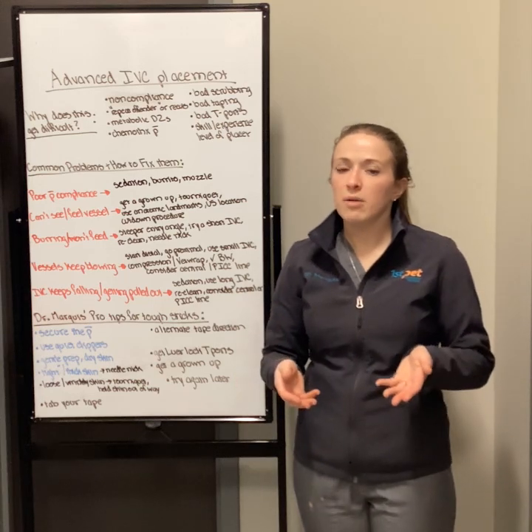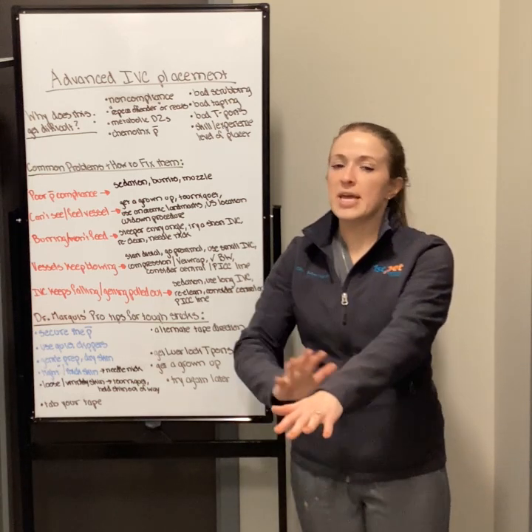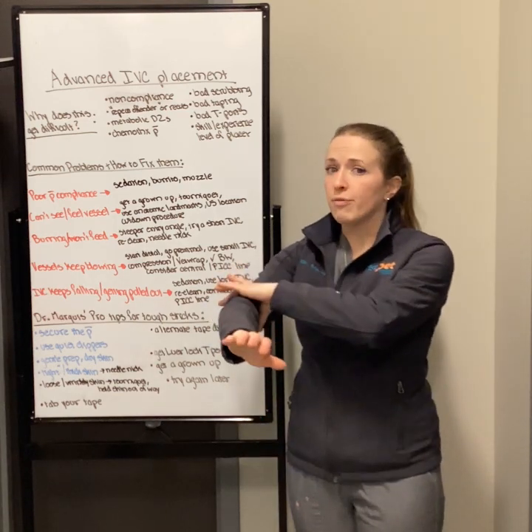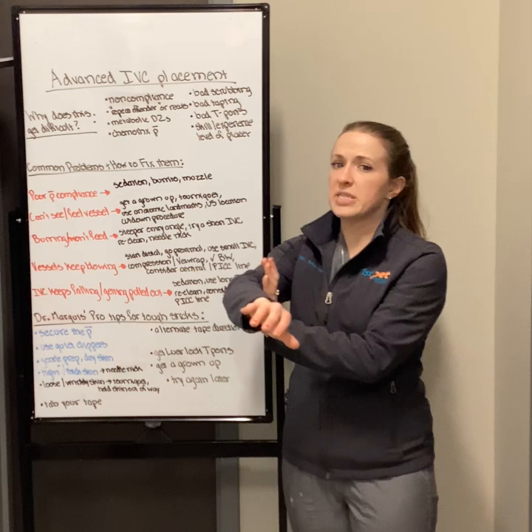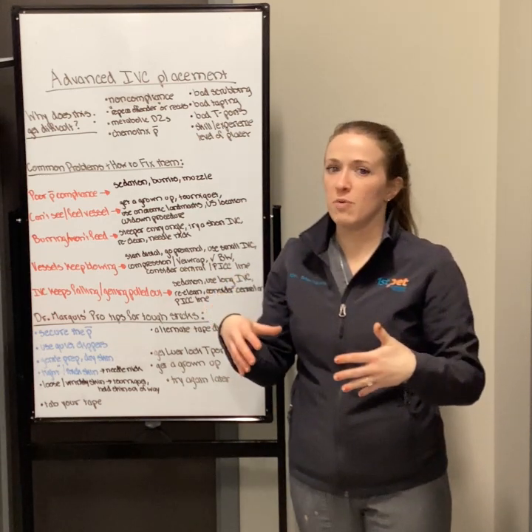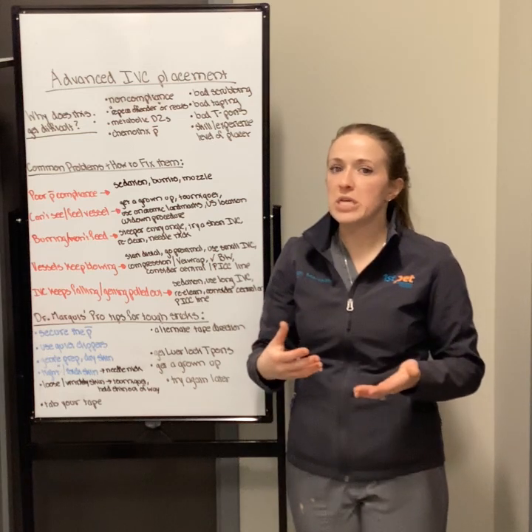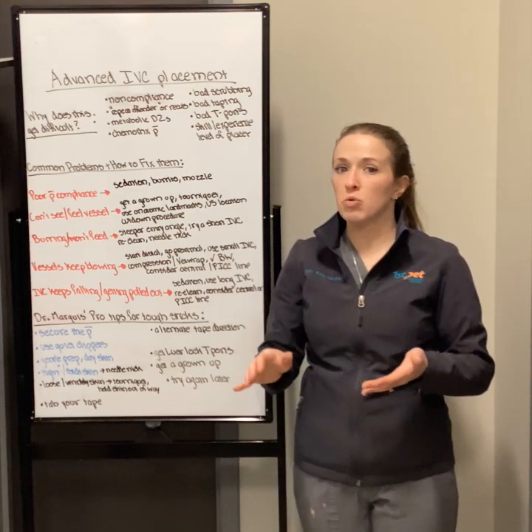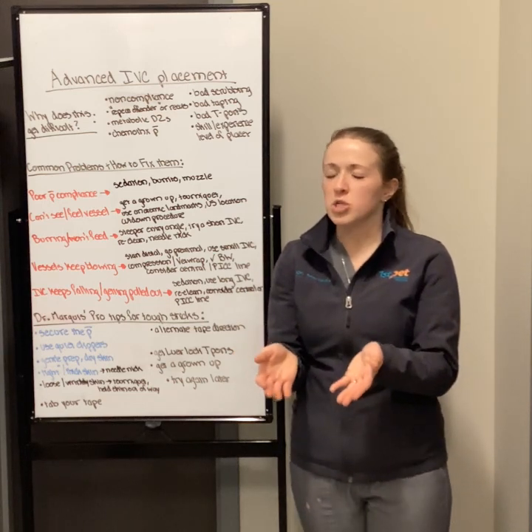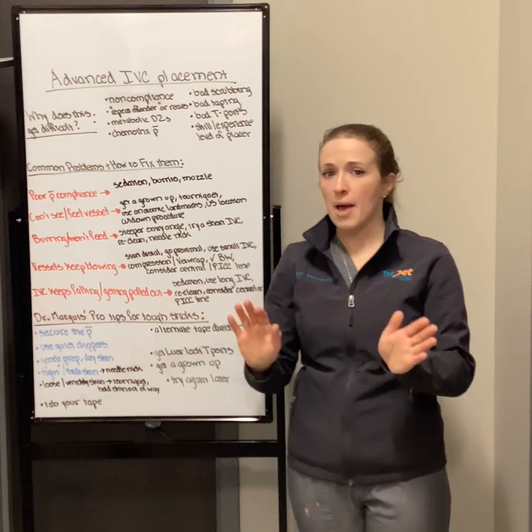When you have an animal like a Basset Hound or an English Bulldog with wrinkly skin in that elbow area, get someone not just to hold off the vessel, but to move that skin flap out of the way and make the skin tight for you again. That in combination with a tourniquet can be a really easy way to start seeing some of the normal anatomy on the foot. And then by using your anatomical landmarks, you can pinpoint, okay, I see this cephalic, this is where it should be, I'm going to give it a go.